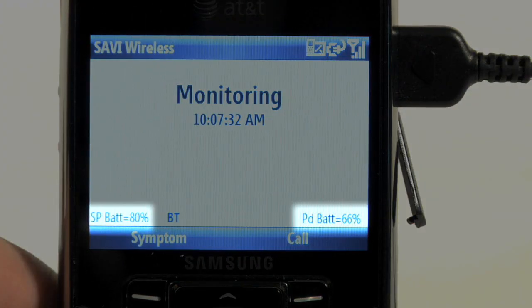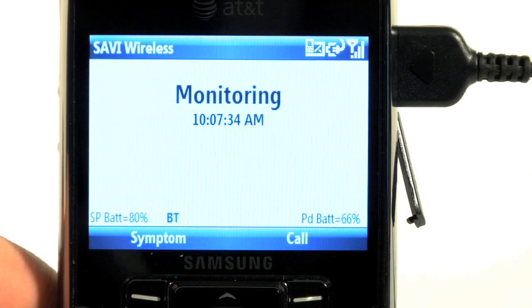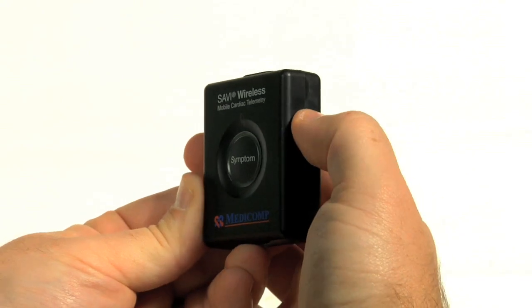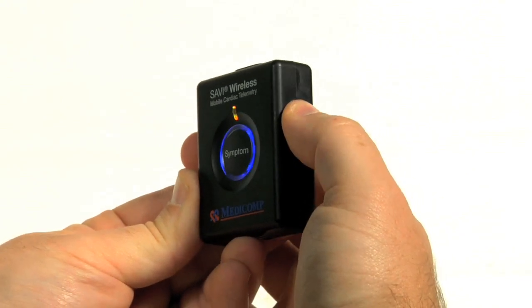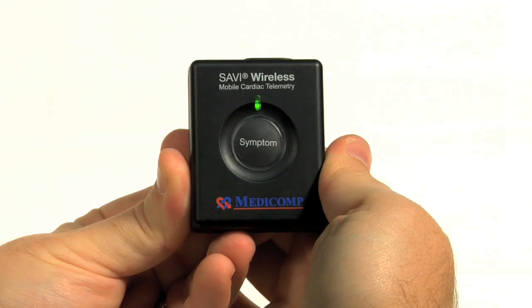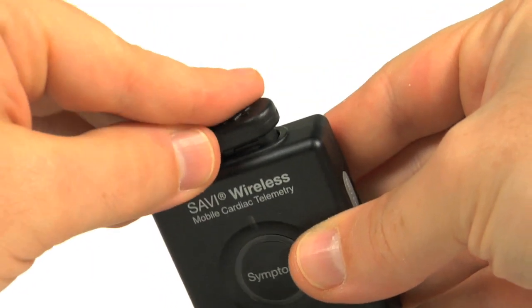Both the pendant and the smartphone will alert you during the course of the procedure when the battery is low. Next, turn on the pendant. Press and hold the on-off button located on the right side of the pendant for a few seconds. Wait until the unit beeps and flashes a blue light, followed by a blinking green light — this indicates that the unit has successfully turned on. Plug the connector that joins the wires into the top of the pendant. The connector only fits one way.